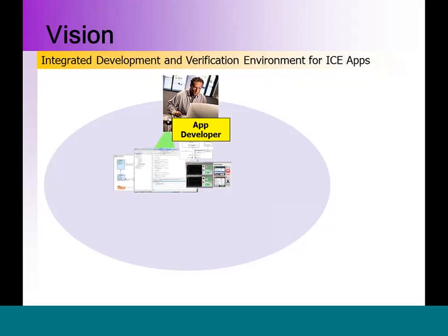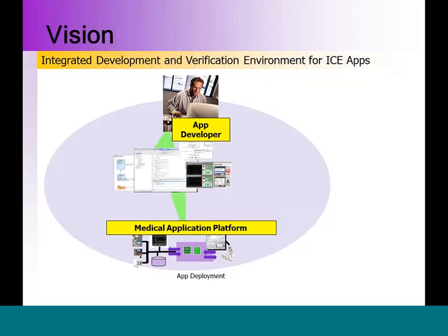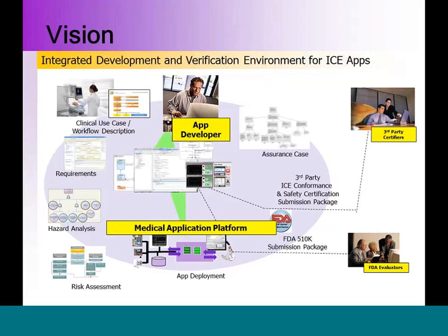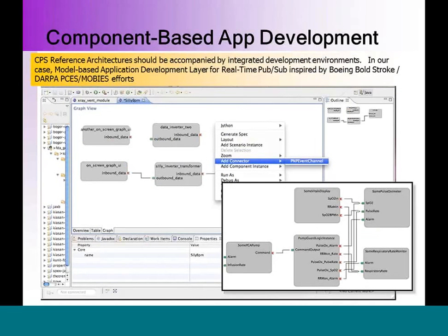And so the vision for all of this is to coordinate the development activity for an app in an integrated development environment where you would be able to help them specify all of that information and then apply various types of tools that help them write requirements, do hazard analysis, risk assessment, and so forth, and also package up things in a form that would be submitted for certification authorities and, for example, part of an FDA 510(k) submission package.